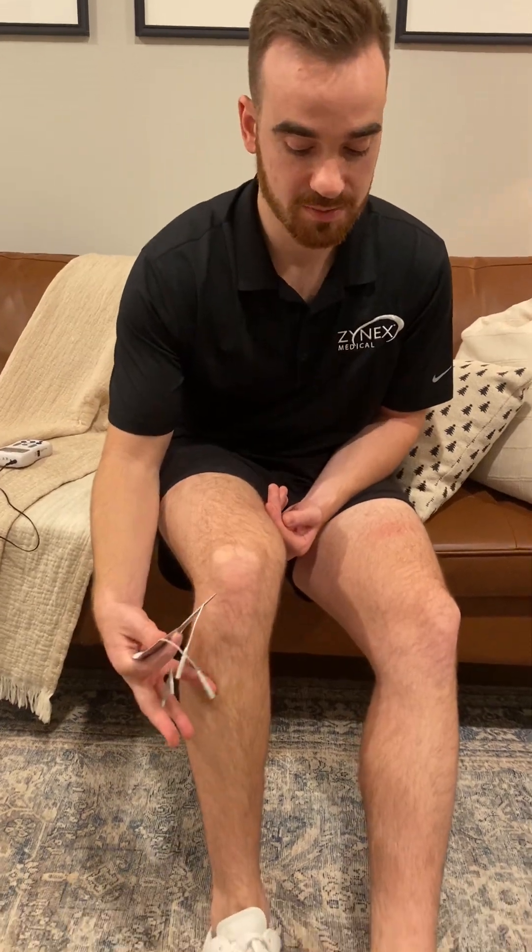That is the muscle that is used to pick up your foot, or dorsiflex your foot. In my first video, I talked about a patient who's had a stroke and because of that stroke gets a foot drop. This would be an indication to use NMES on the anterior tibialis muscle to learn how to pick up that foot again, to strengthen that muscle, to prevent atrophy, etc.